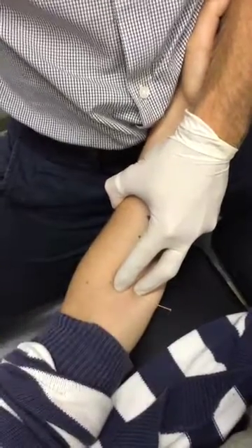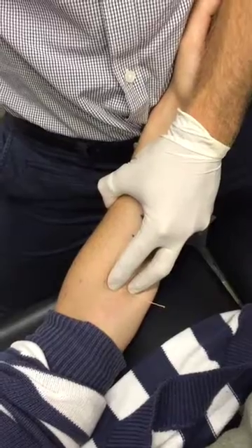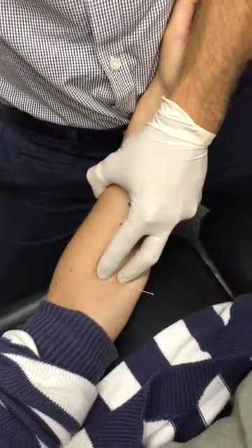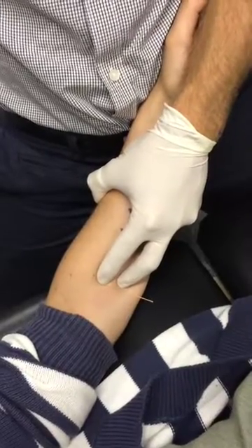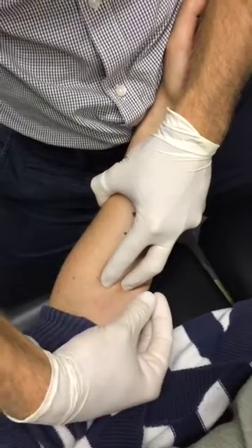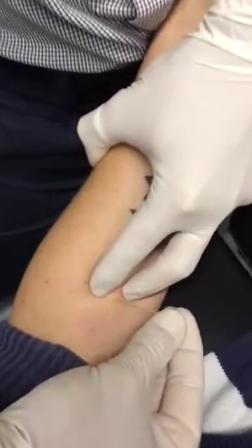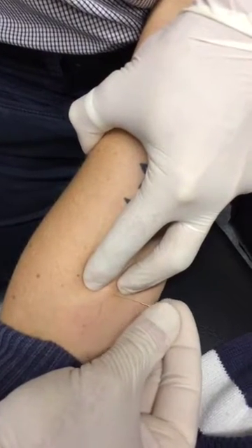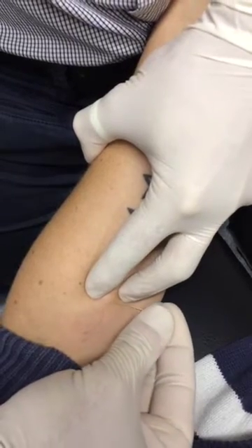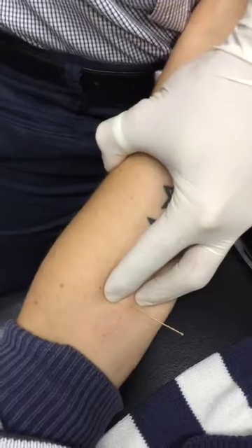Straight away — bang. Sometimes if you're right over it, although sometimes you need to needle deeper through there, if the muscle's quite irritated you just hit that fascia and you get the twitch. Did you see that, Sam, in the video? Let's see if we can get another. Alright. Cool. Good — plenty of things happening here.